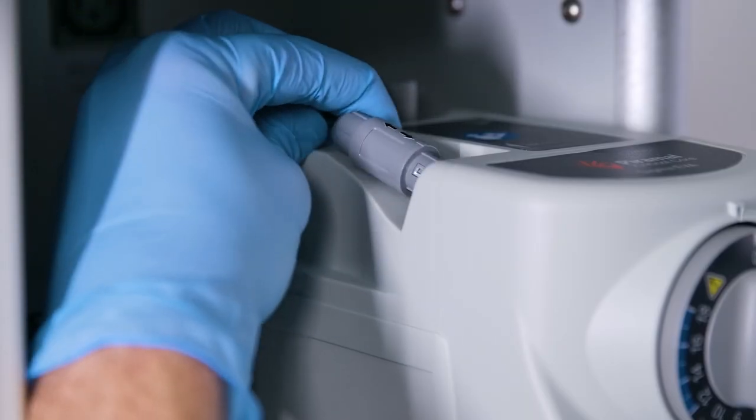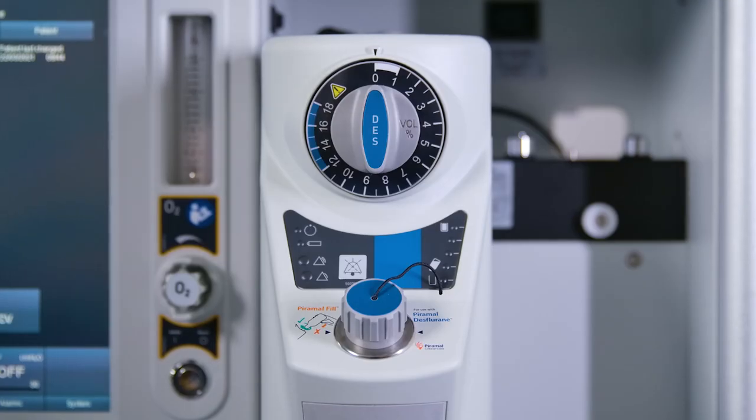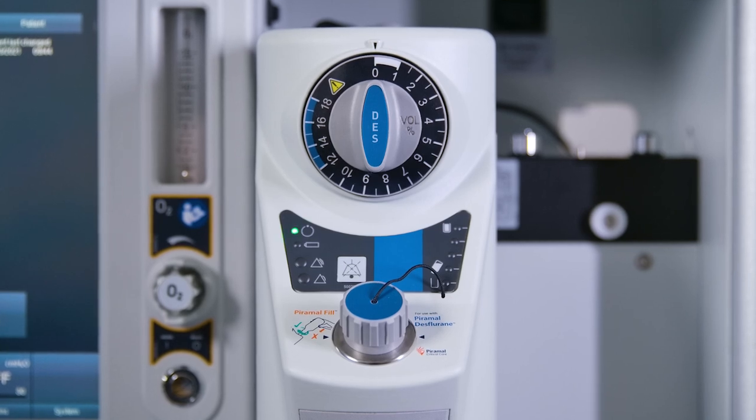Connecting the power supply: connect the electrical power supply cable to the socket on the vaporizer top assembly. The power indicator will flash when the power is first connected.